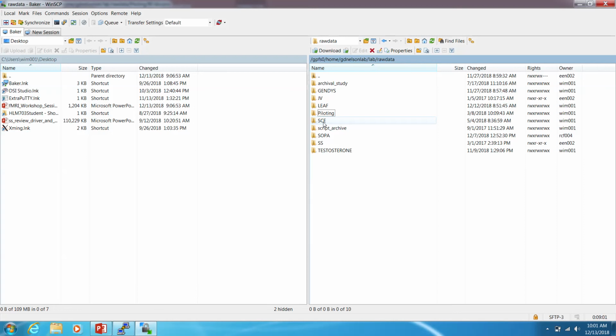the NIfTI format. In this case, it's the program AFNI that we use, which breaks that up into two files. One is a header file, and one is the actual binary data. So all the text gets converted into our file header, and all of the binary data that came at the end goes into the actual imaging information.